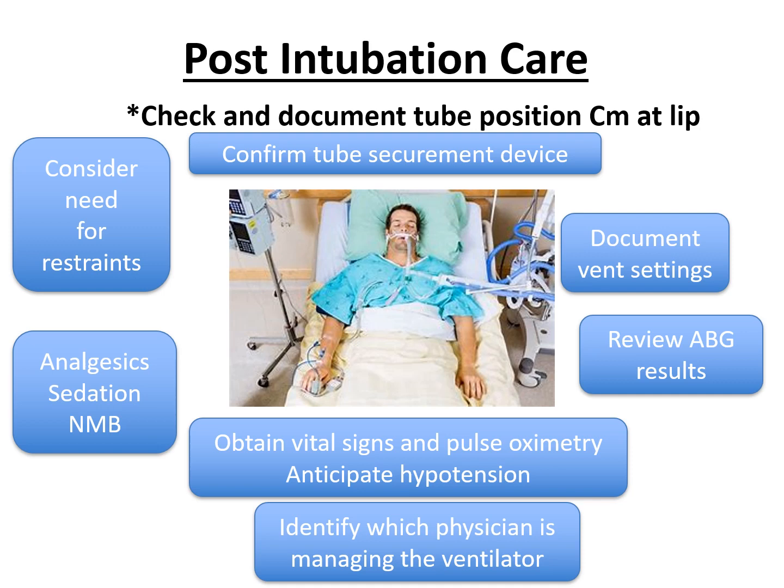Other things you need to do is review your ABG results. You're going to get ABGs before you even intubate the patient, indicating that the patient needs to be intubated, but you also need to review the ABGs after the vent was set up, and then every time the ABGs come back, you will need to notify the doctor and the respiratory therapist if there are any changes that need to be done on the vent settings.